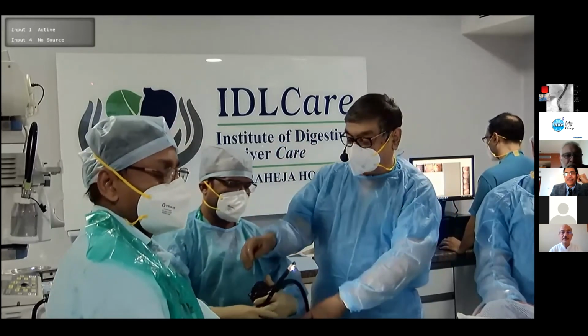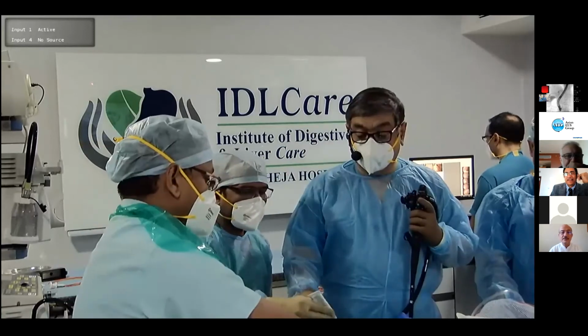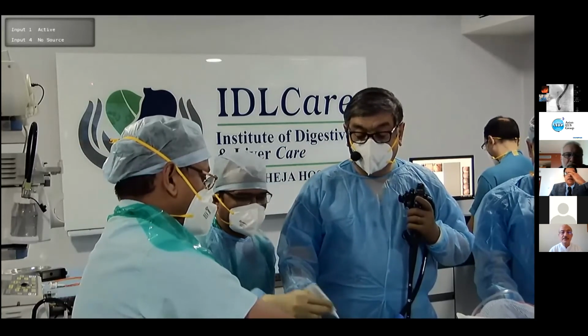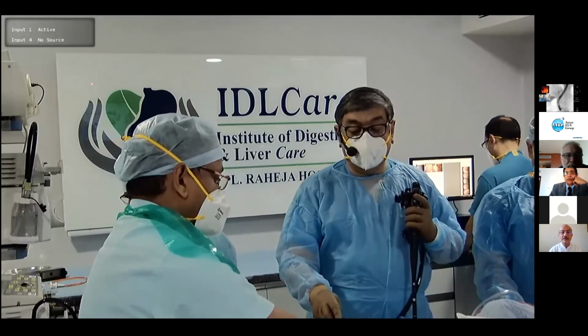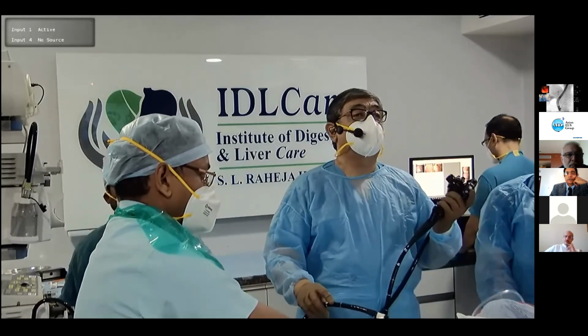So I am using a linear EUS scope. Those of you who were there when I talked about linear EUS yesterday, you can see my hands. This is how I hold my scope. I'll give you very simple. Okay, where is the camera? Can you move the camera, please? Bibin.